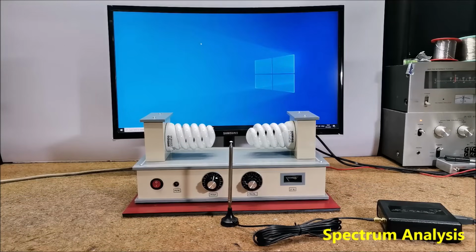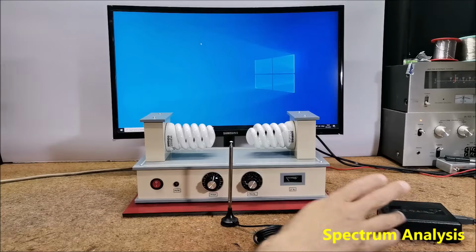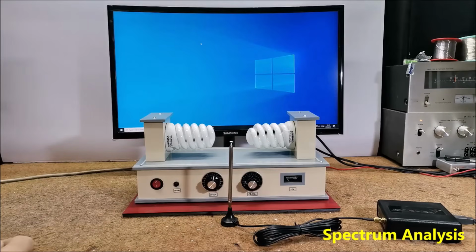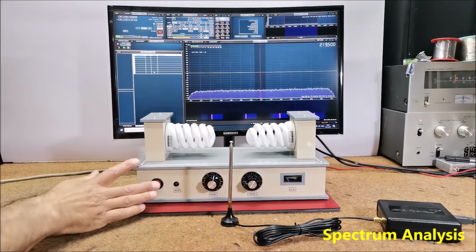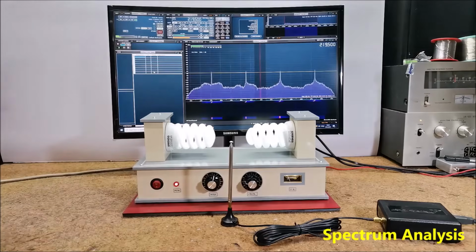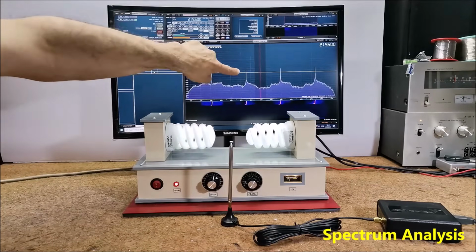We will detect this signal with a spectrum analyzer, in my case this small SDR radio, and special software through this small antenna. This is the spectrum analyzer software. Now when we turn on the device, we only see the carrier signals. So these are carrier signals.